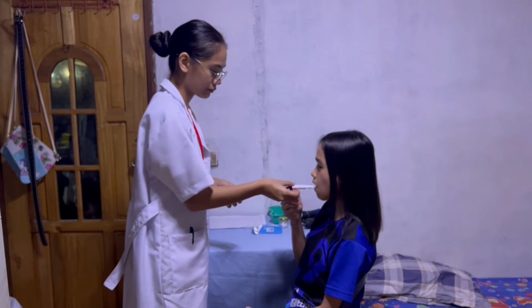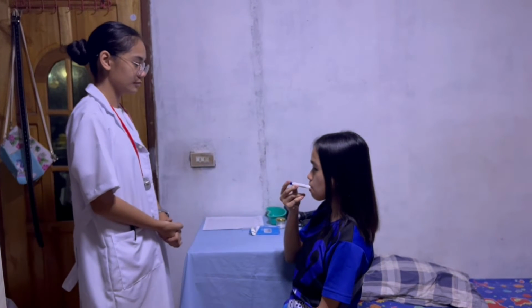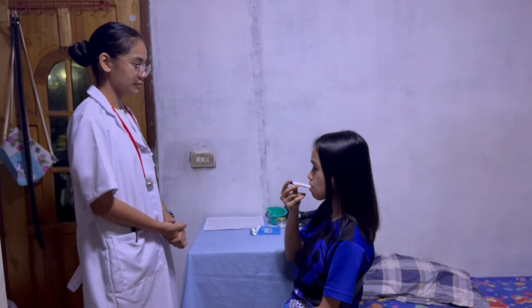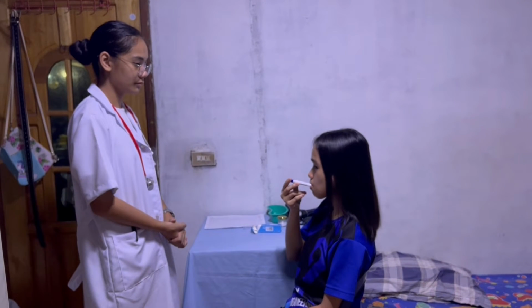Place the thermometer tip under the tongue in the posterior sublingual pocket. Make sure that the client closes their lips around the thermometer to protect the thermometer from exposure to the air, which could alter the reading.